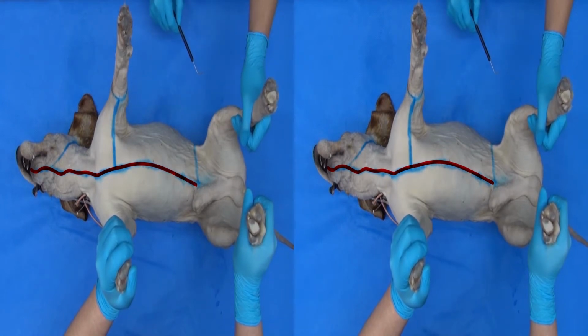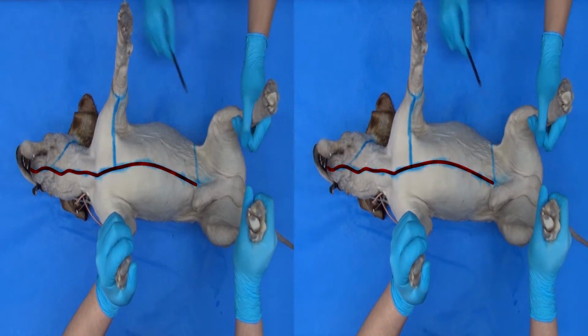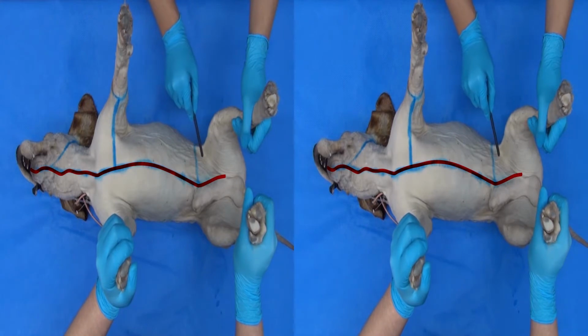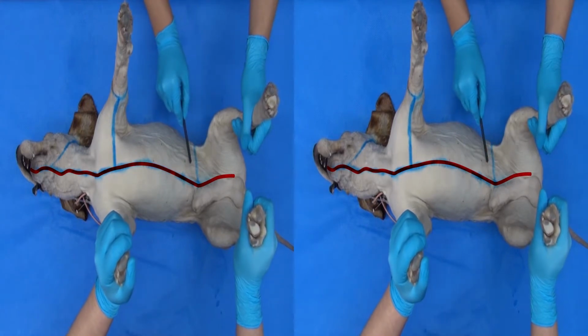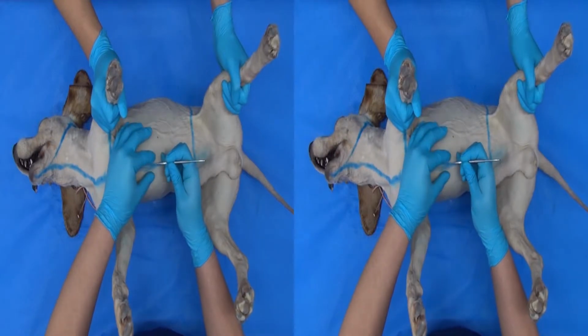However, exposure may be insufficient in small dogs. Extend the incision caudally as needed. In male dogs, if the incision line passes the genitals, make a paraprepucial incision as close to the genitals as possible. Incise through the skin along the incision line.